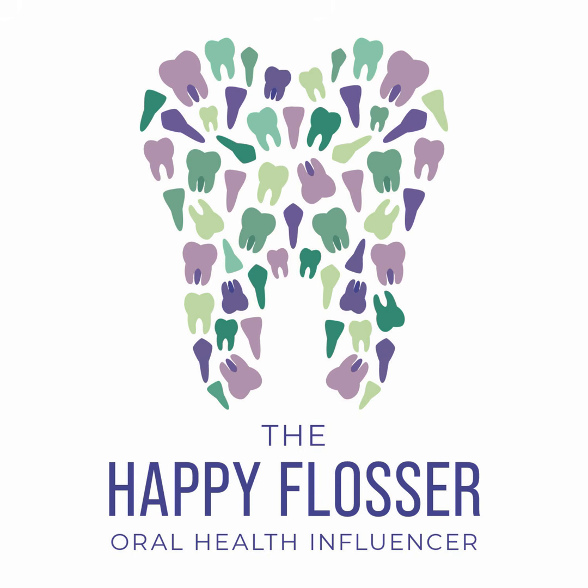And you also want to communicate with your patient about the procedure. It helps build trust in that communication process on what is happening, what you're doing. And you can even tell the patient, for example, that this sets up very quickly in your mouth, so it won't be in your mouth long.